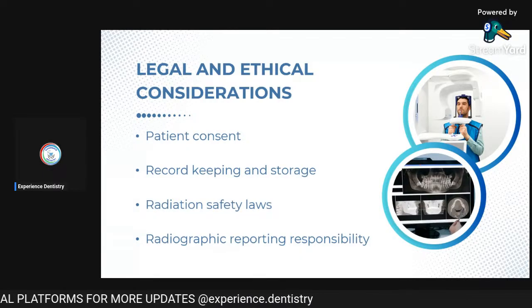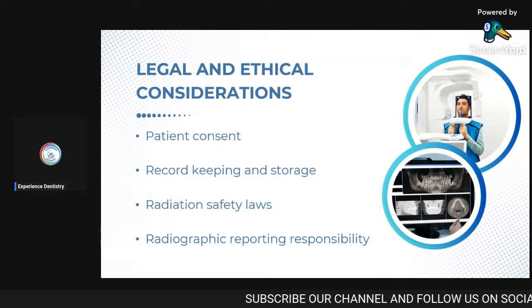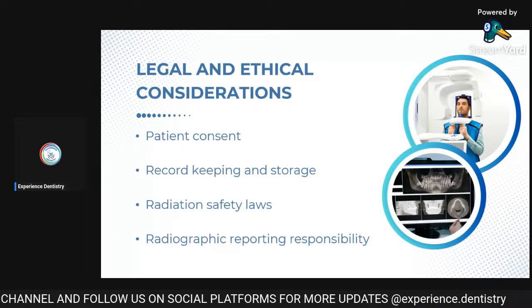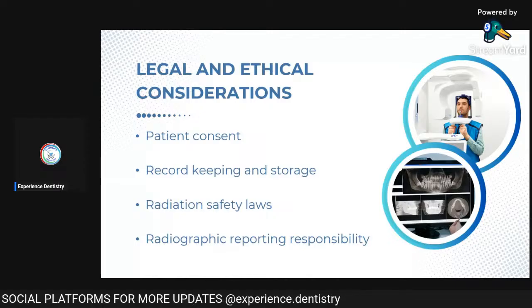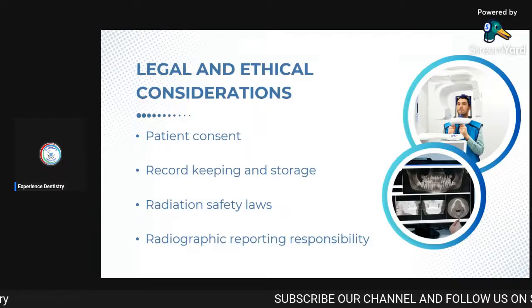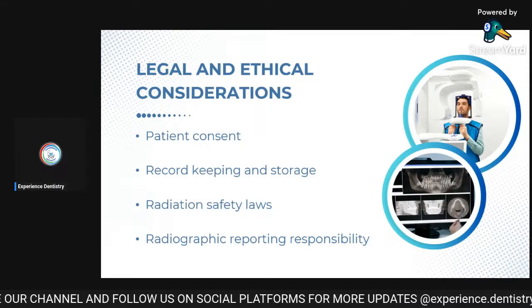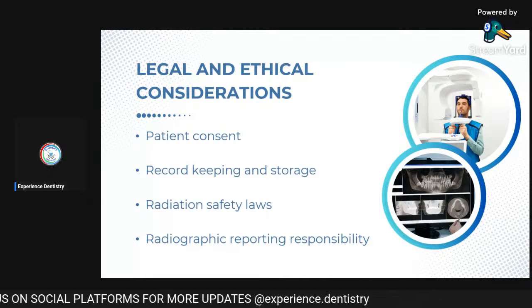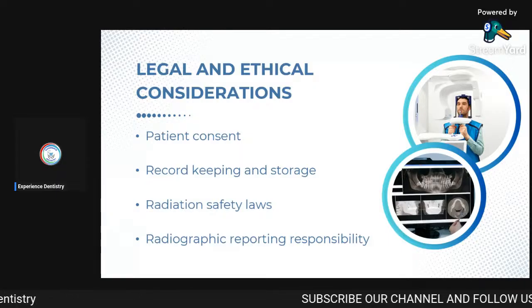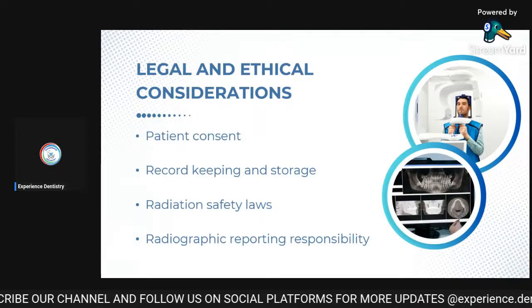Then you need to keep their record storage. Make sure that you at least have a file copy or a picture stored in your database for record purposes. Most of the time in Pakistan, people lose their OPGs and X-rays. But now it's the digital era. Thanks to the technology, we can easily save these X-rays on our computers if we are following digital radiology. Otherwise, it's better to take a picture of the radiograph and keep it in your clinic or hospital data record as well. It will make your life easier. You don't want to take an X-ray of a patient again and again, and you don't want to expose him to harmful rays if there is no need.